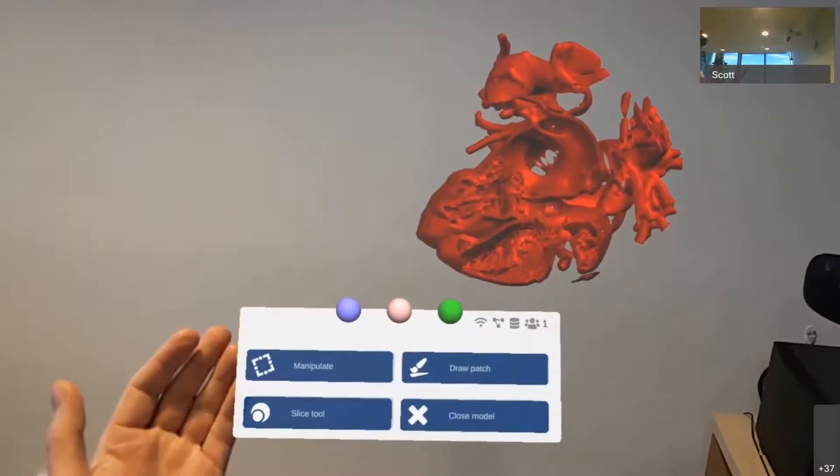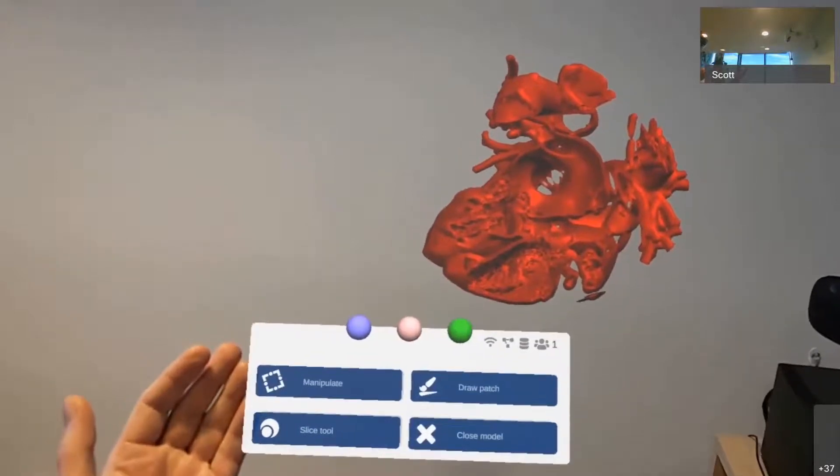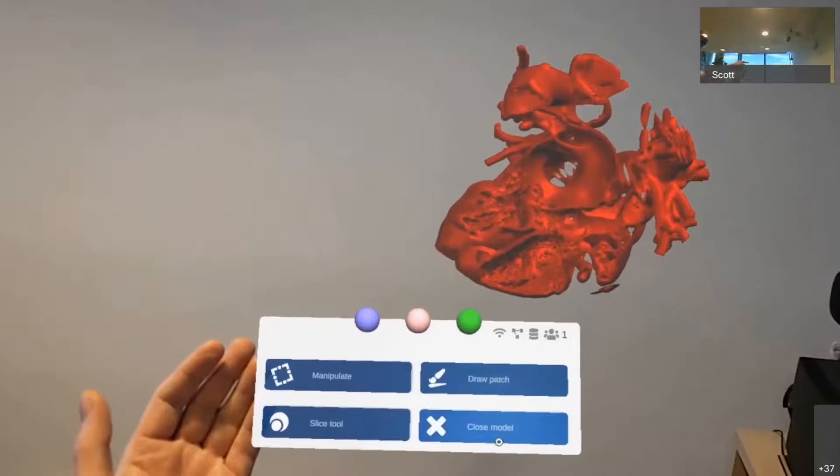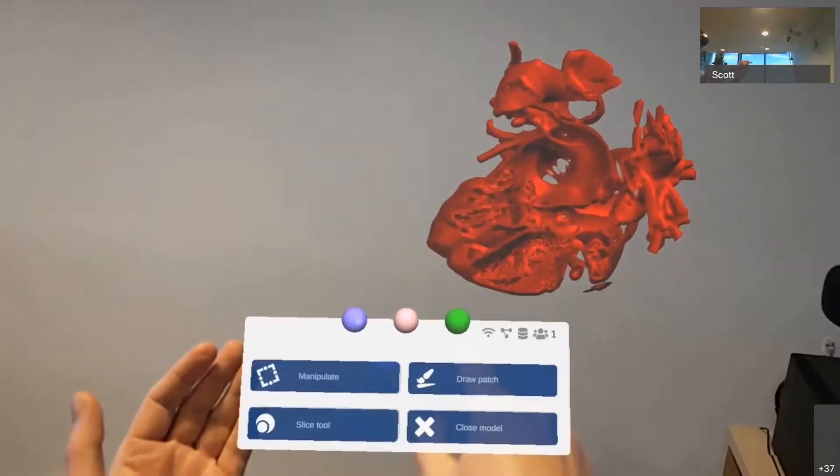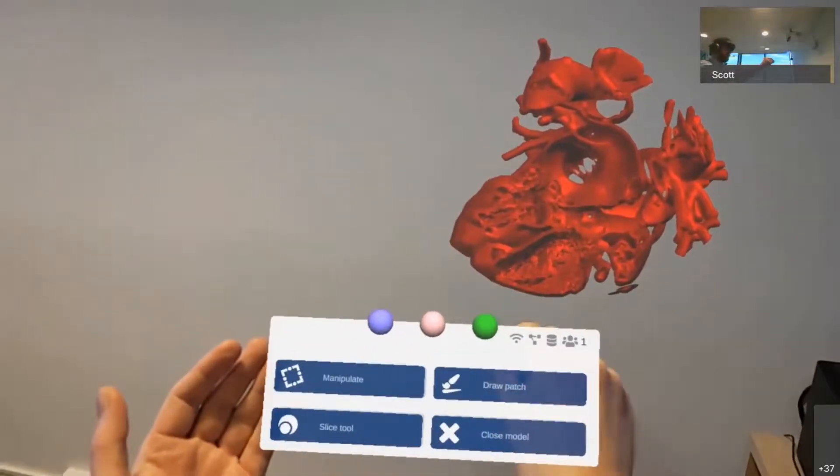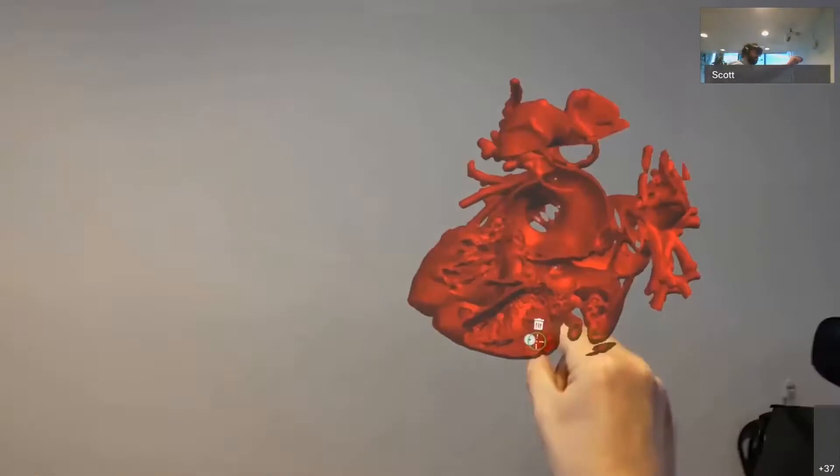If I want to indicate points of interest within the heart, I can use these markers that are sitting on top of the context menu. And I can grab those markers and place them in the heart.